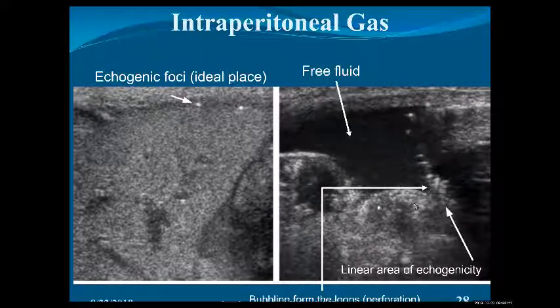The bowel air. Yeah, I can see. Bowel wall air, and then perforation. And then you can see bubbling, moving up until the skin. And there is fluid outside. So very nice picture.